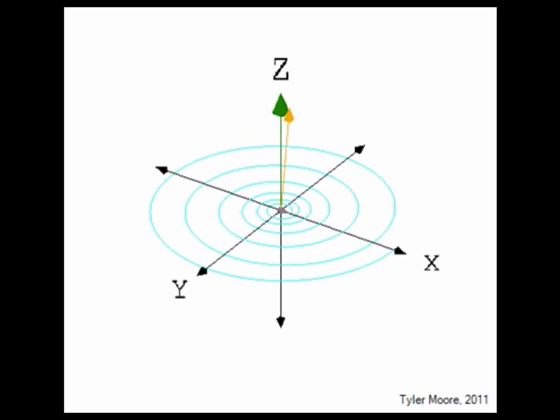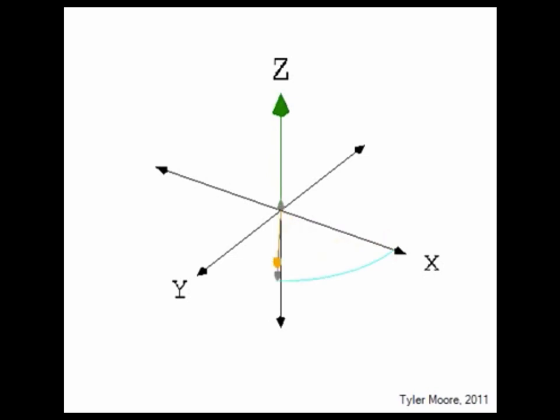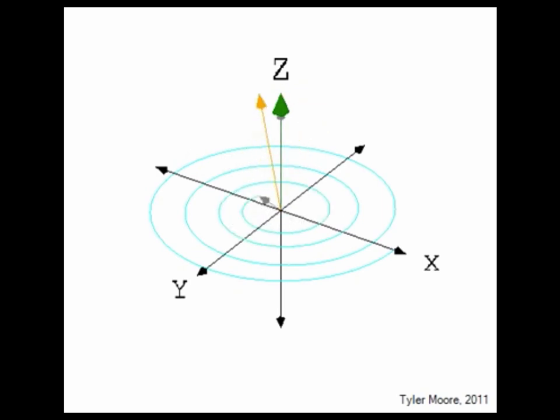Absolutely. So just look at how this bit here is regrowing. This represents the population of protons in their natural state growing back to equilibrium, where there's a characteristic population proportion in the low energy versus high energy state. So this is just essentially reestablishing that population.